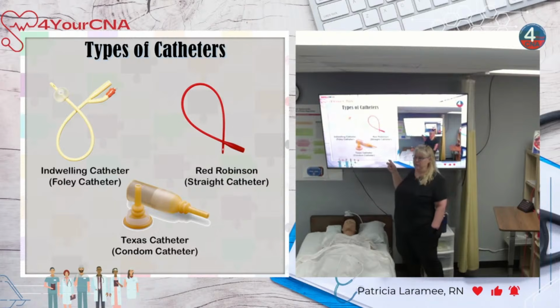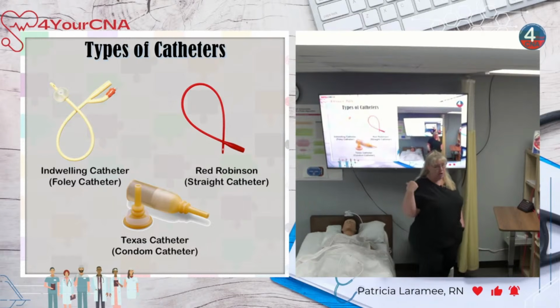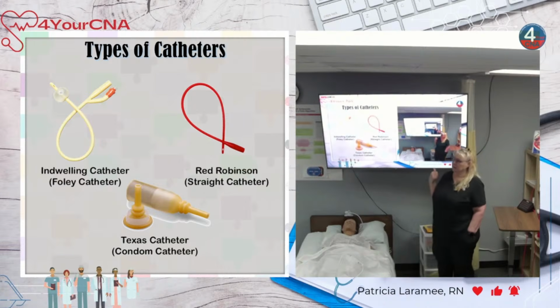These, when they're put on, are generally left on up to 3 days. Now, the nice thing about condom caths or male caths is that they aren't invasive. We're not putting anything into the body. The urine is coming out normally. It's just being diverted into a bag. Make sense? So there's less infection risk. The problem with this, and it is a big problem, is that these are not used without some thought to it. You would kind of have to think this through.